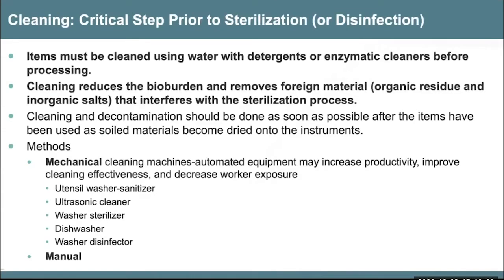And in fact, there really are at most, certainly less than a handful of reported problems with steam sterilization leading to infection. And when we do see problems, it's because of a human error, not steam sterilization. People putting something into a steam sterilizer, leaving somebody else's tray in the steam sterilizer, removing it, not realizing it was not properly sterilized.